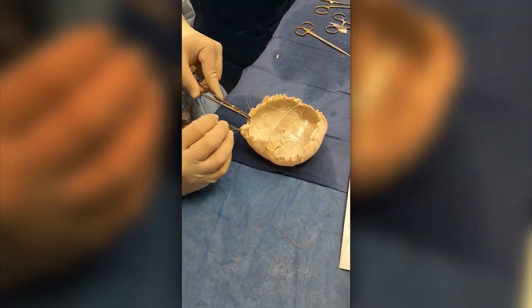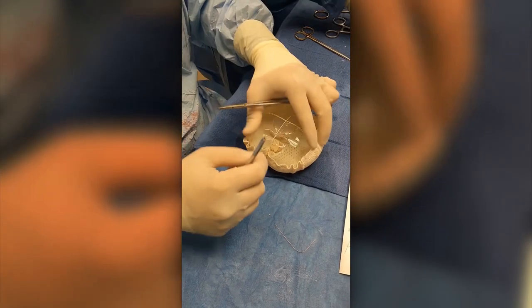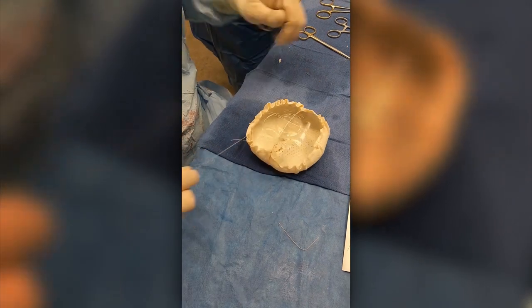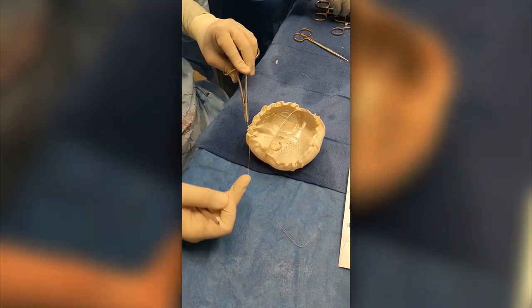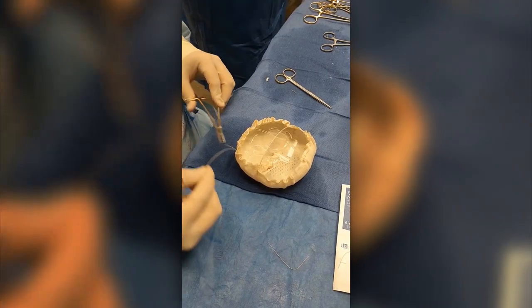It creates a little bit of crimping around the edge, but nothing that translates to the front of the device as I'll show you when we're done here. This is all going to be on the back side, which is going to go against the chest wall, but we're also going to smooth this out quite a bit once we put this back wall coverage on.